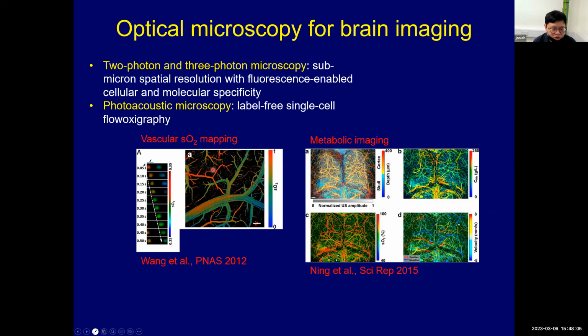That's where you form the image, which is why I call it photoacoustic microscopy. It's quite powerful in the sense that it allows you to get a lot of contrast from the absorptive nature of the cells. For example, you can get the saturation of the vessels and things like that.